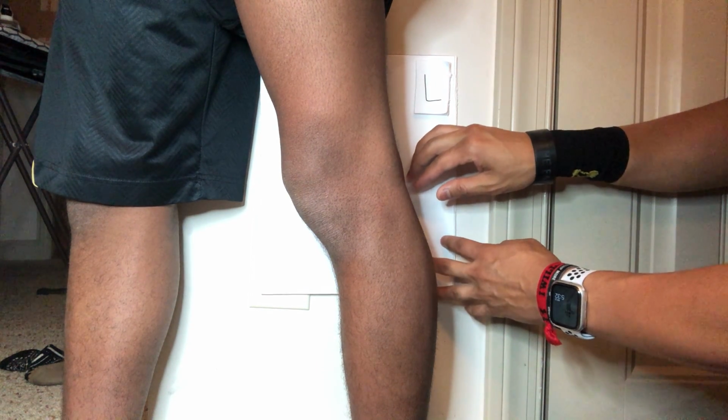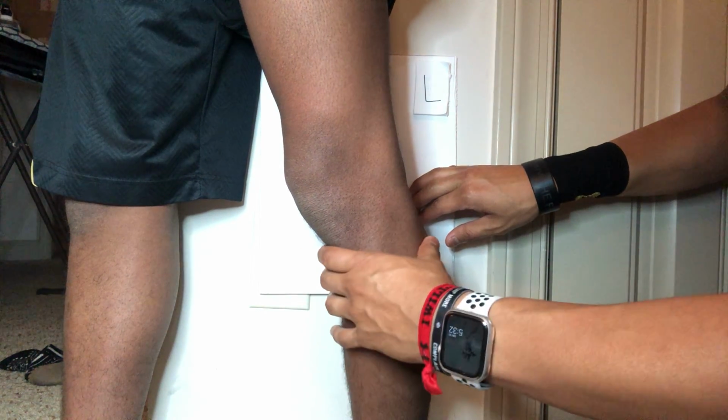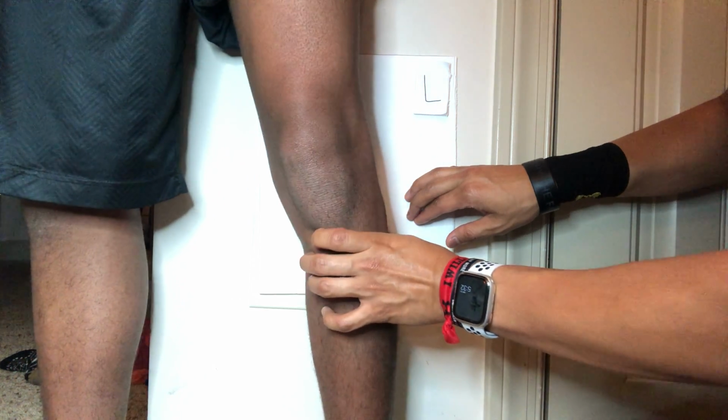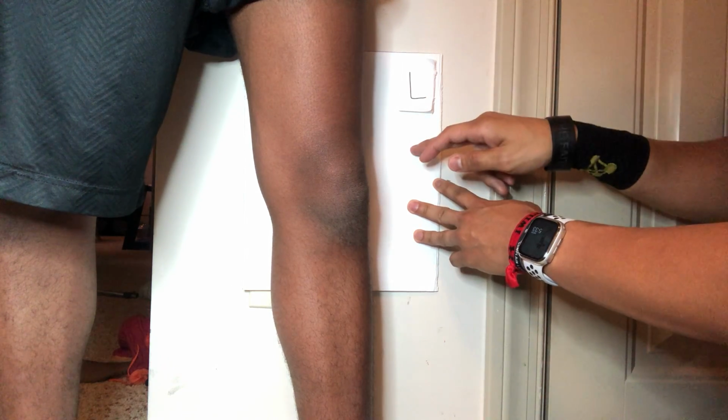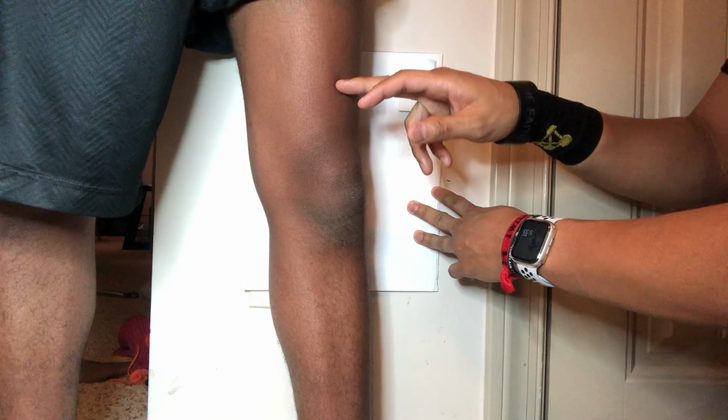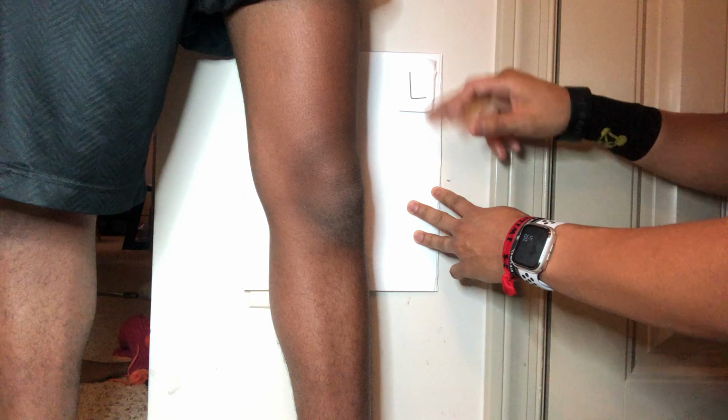Next is going to be our lateral oblique knee. In this case, we're going to have the patient rotate the knee 45 degrees externally, 40 SID on a 10 by 12 image receptor. Left leg, so we're going to have the left marker.